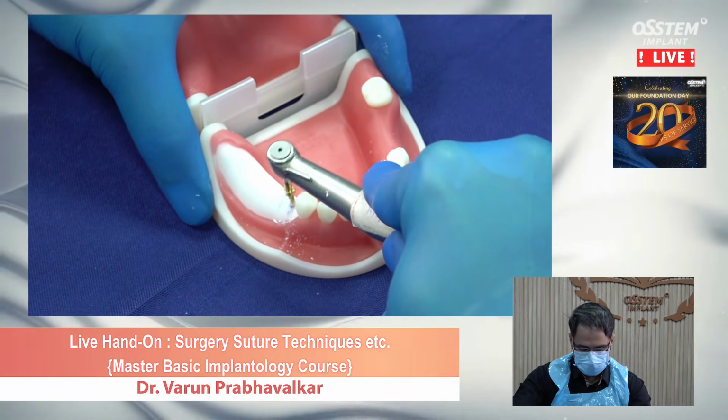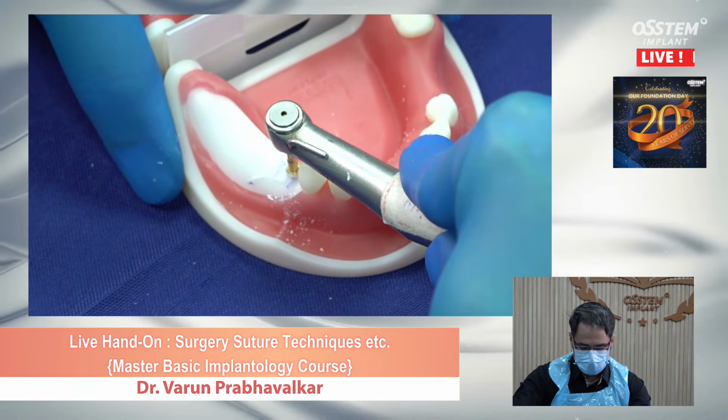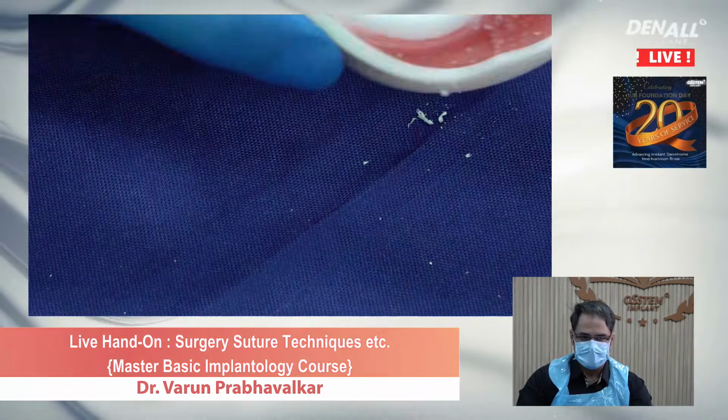Okay, drilling, go one depth down completely and out. Okay, our osteotomy is complete.